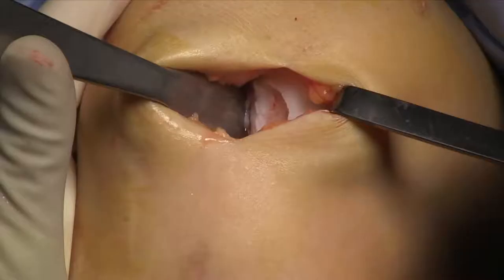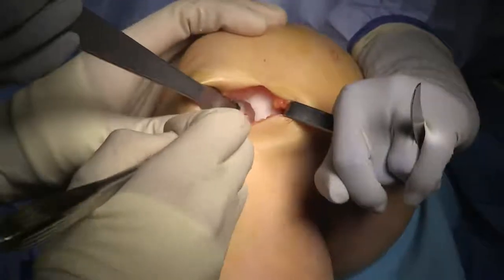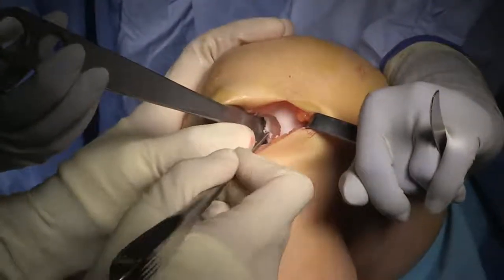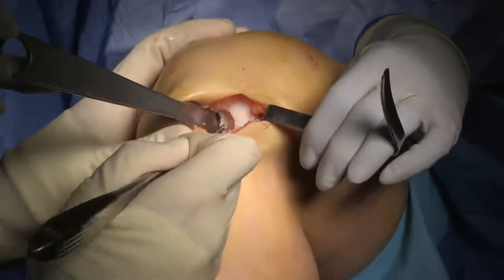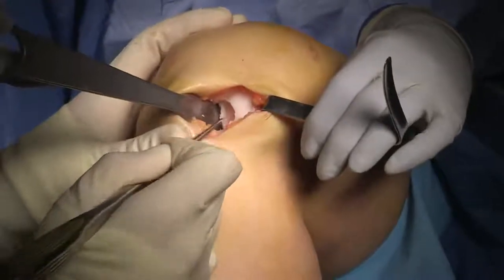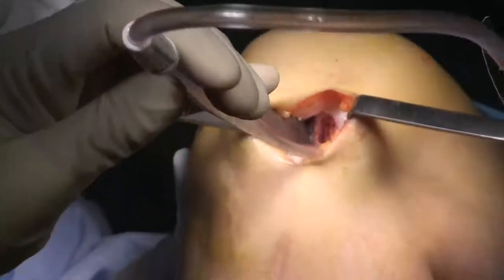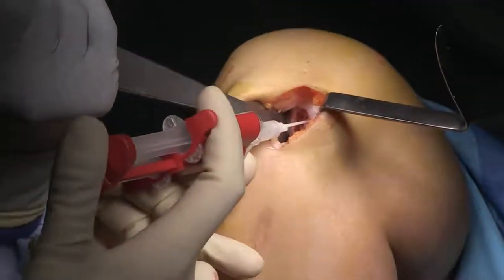Even after using the instrumentation, there's usually still some tissue which needs to be cleaned up. I take a curette to remove the remaining calcified cartilage layer. The instrumentation does most of the work, but the fine touches are done with a small curette. The next step is to perform a microfracture, and you can see I've done that here. Now we use a bit of suction to help dry off the underlying layer in preparation for applying fibrin glue. You can see I'm applying fibrin glue to the base of the microfracture site.